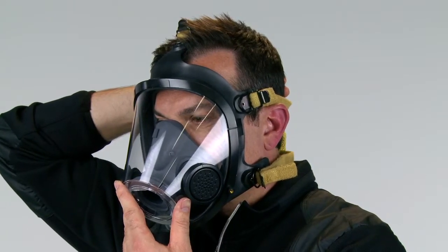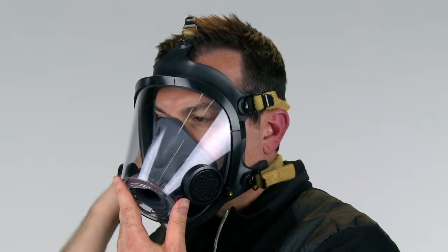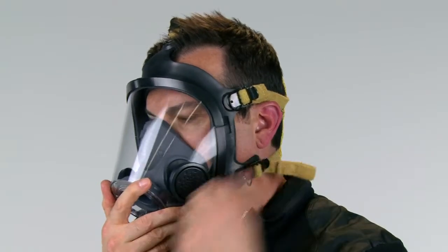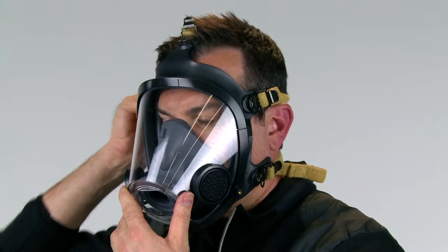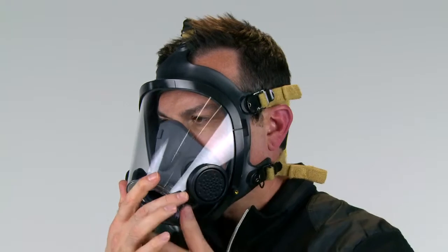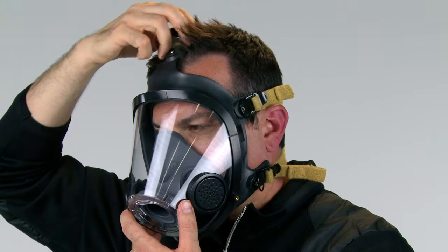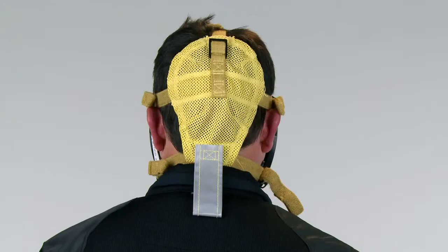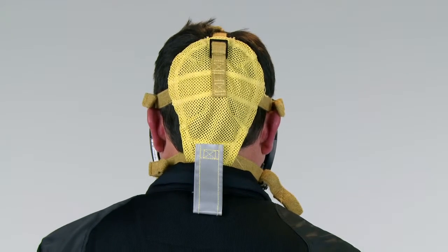While holding the facepiece in place with one hand, gently tighten the neck straps evenly one at a time by pulling each neck strap toward the rear of the head. Alternate hands to maintain the facepiece in position on the face. Continue by tightening the temple straps evenly one at a time by pulling each temple strap end toward the rear of the head. Tighten the forehead strap by pulling it toward the back of the head, being careful not to over-tighten. Verify that the head harness is centered on the crown of the head and lying flat against the back of the head.